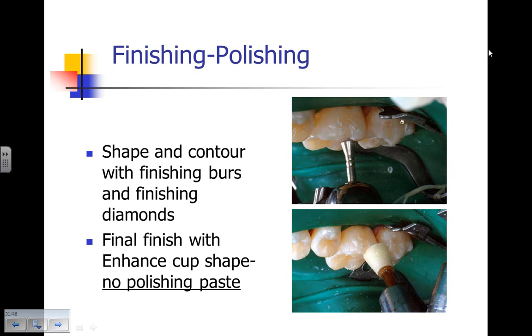We only need to get posterior composites smooth. We don't need to get them to be lustrous. The patient has to be able to sense that it's smooth to their tongue. We don't need the extra step of using a polishing paste.